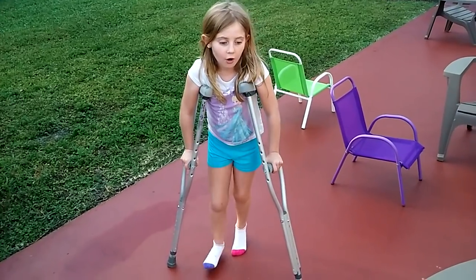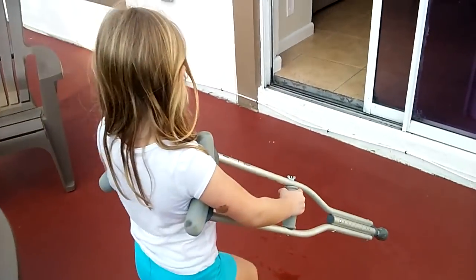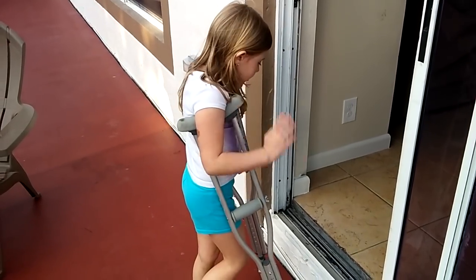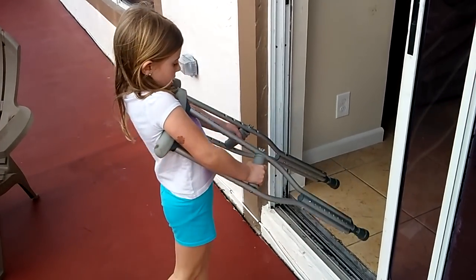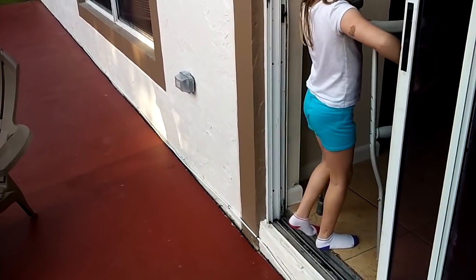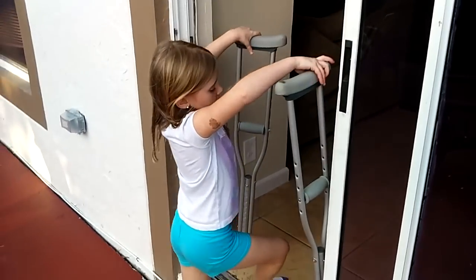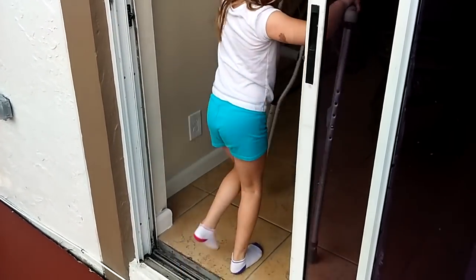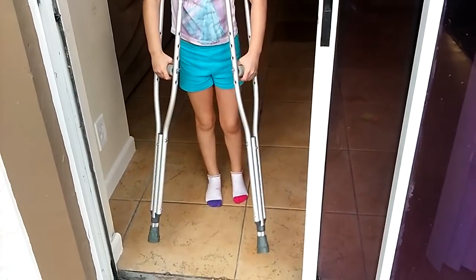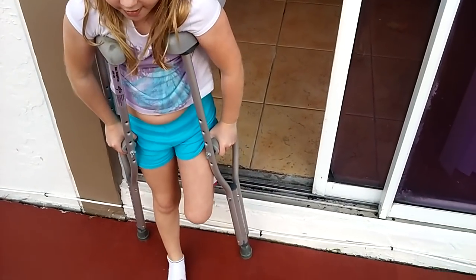And now I am going to show you how to go by stairs. So you are going to walk over here. And what you are going to do is, you are going to put your crutches up first, like this. You are going to put your crutches like that, and you are going to walk up. But I am going to show you how I go down. So I am going to hold my crutches like I did. And then what I am going to do, with my injured foot, I am going to put my crutches down, and then jump with my good foot down.